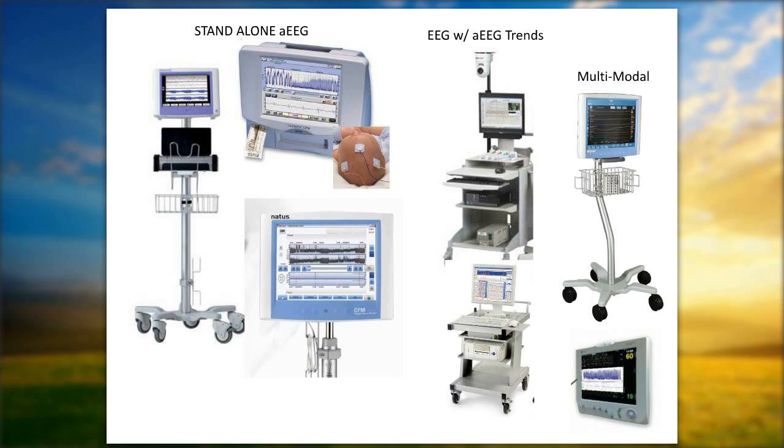Maybe you have it connected to your NIRS device for a cardiac baby. Maybe you have it connected to the Philips monitor for a preemie. And so by being able to have your aEEG and also other physiologic data like temperature, heart rate, saturations, regional saturations, you can then begin to see the neuro trends a little bit easier.